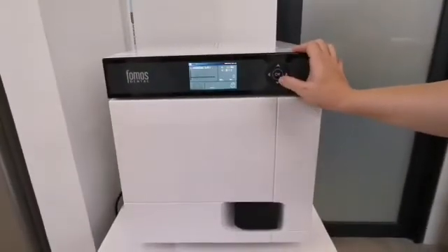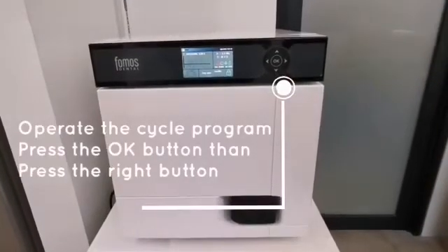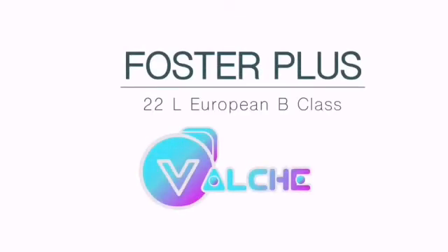To operate the cycle program, press the OK button, then press the right button. Foster Plus, by Valke Dental.